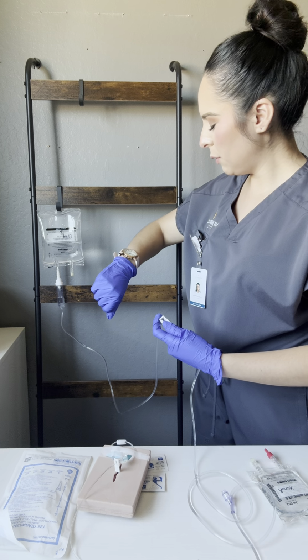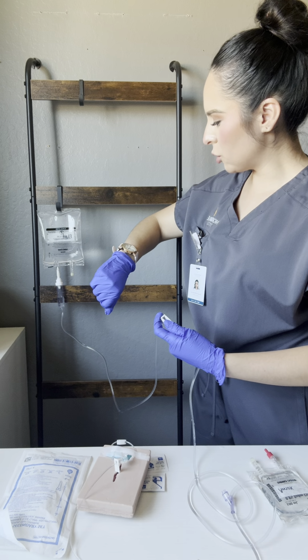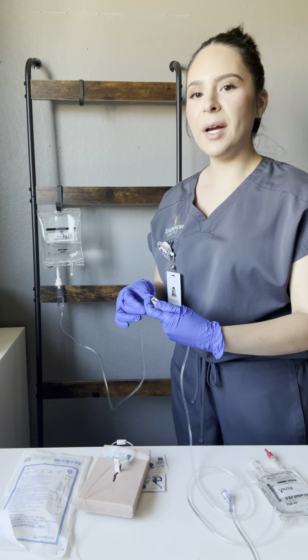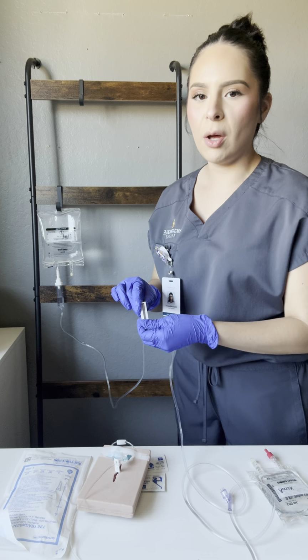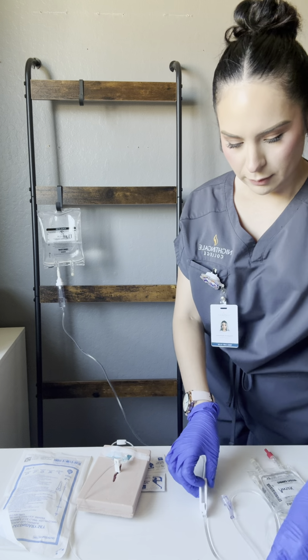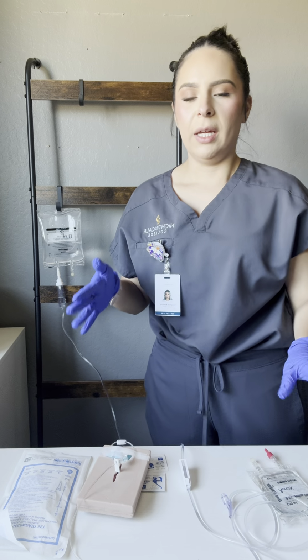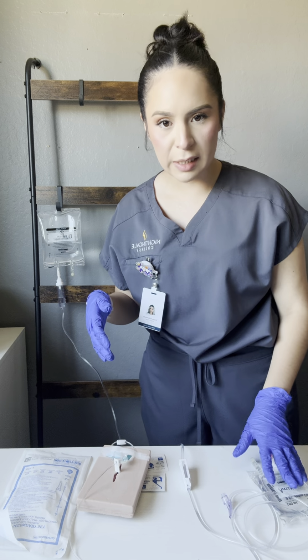Okay, we've counted for 1 full minute and we are at 38 drops per minute. In the real world, I would let this line run, but for this video's purposes, I'm going to roll down on the roller clamp to close our line. The next thing that I'm going to want to do is spike and prime the tubing for my amoxicillin.